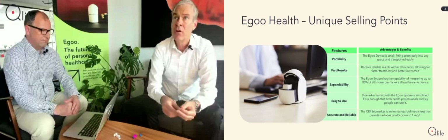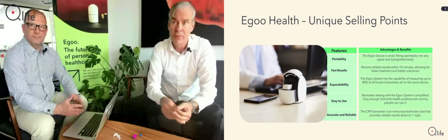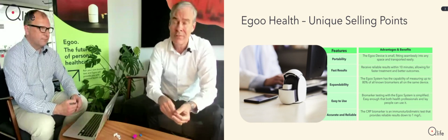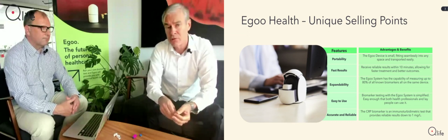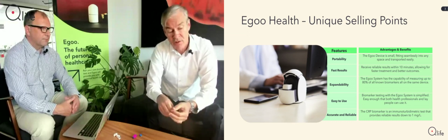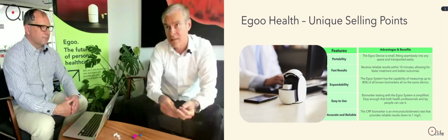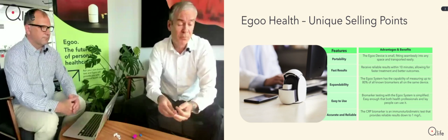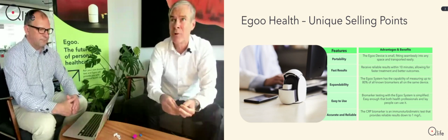So basically, in terms of Qlife strategy forward, we developed this system. As everyone can see, it's a very portable little smart system. It's actually a mini laboratory, you can call it. It executes a lot of these different functionalities that a big auto-analyzer in a central laboratory does. We are quite proud of having been able to put all that into this very small little box.